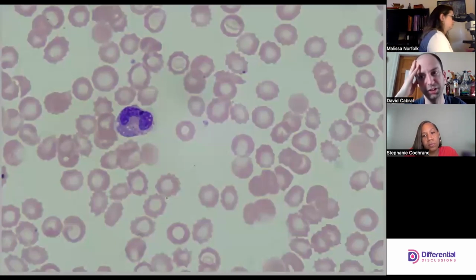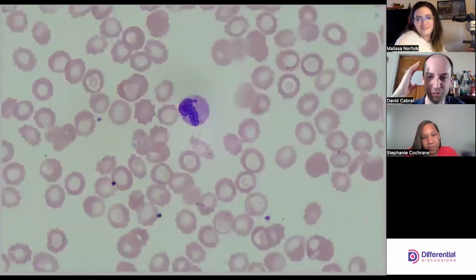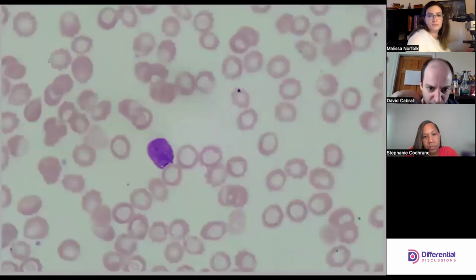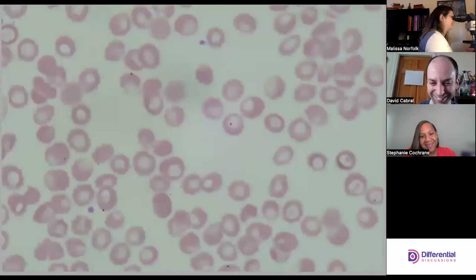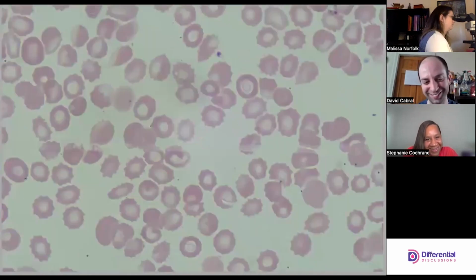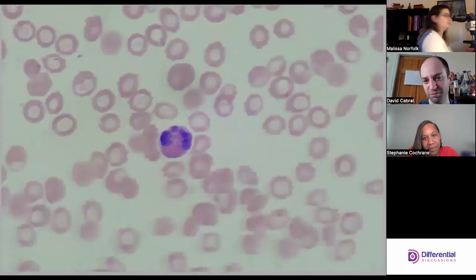Thank you, Melissa. She's such a saint. Looking at these two white count. Okay, so another neutrophil, similar staining. Echinocytes still present. And then there was a cell that was just off. It's just a smudge maybe, or a fragment, whatever. That's tough to square sometimes with the students, I'll tell you. Don't look at that one. Just keep going.